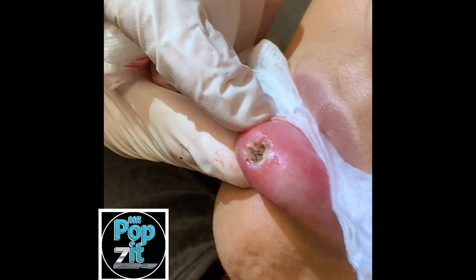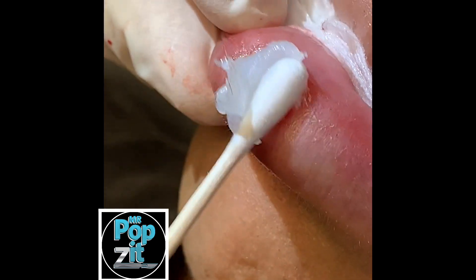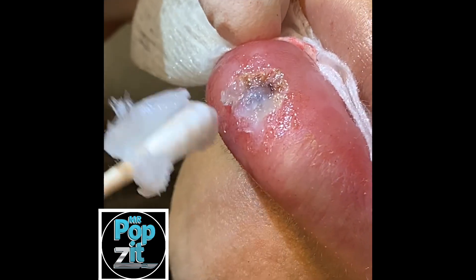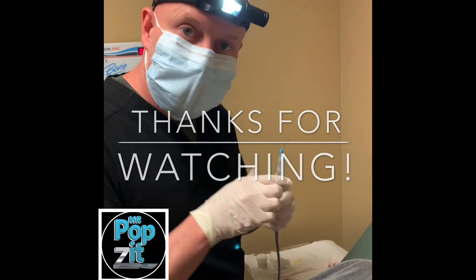Good, that's it. Just a little scab. You can put Vaseline on there. And this one here — just a little globule. We send that out to make sure it's nothing precancerous or anything like that, which I don't assume it to be at all. And that's it. All done.